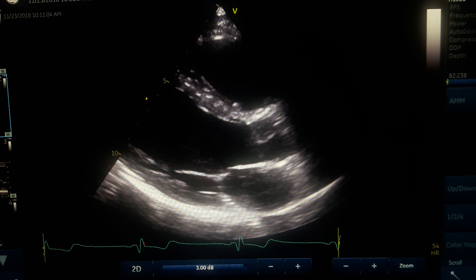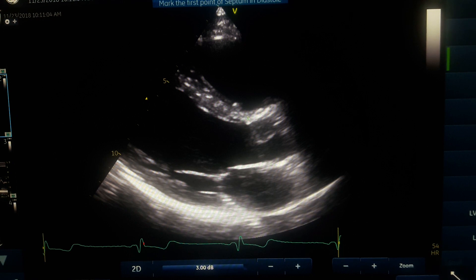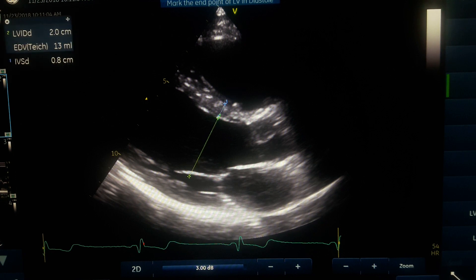First, we measure the IVSD — the interventricular septum in diastole. Don't measure too close to the base of the IVS because it becomes thinner there; go a little further. Measure without including trabeculations or chordae tendineae — just measure exactly from the endocardium. Start here and make sure you are perpendicular to the wall. This gives you your IVS in end-diastole.